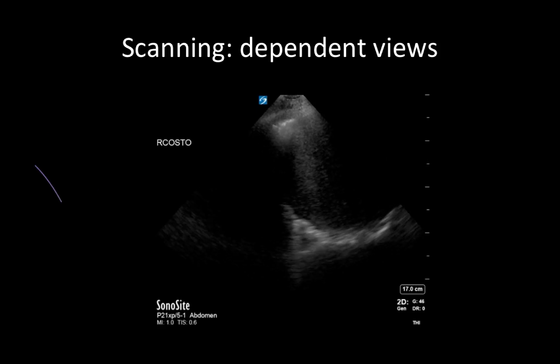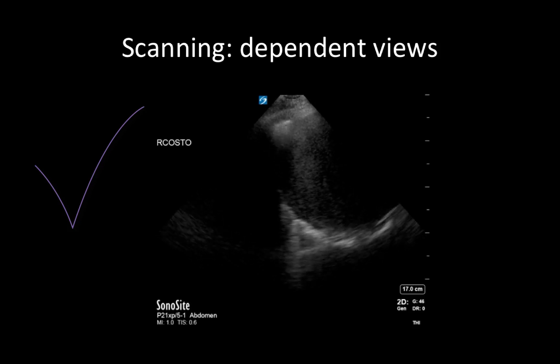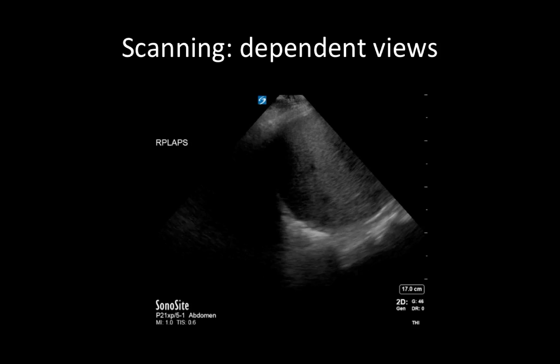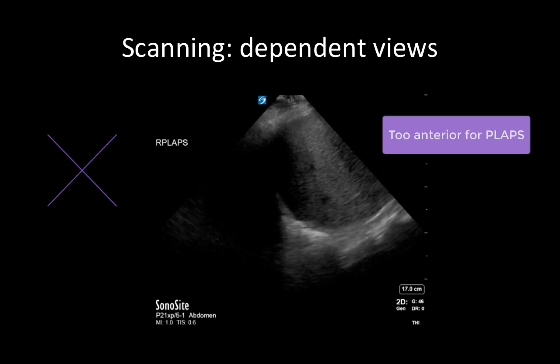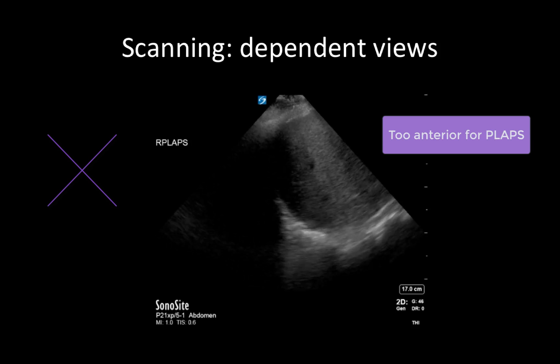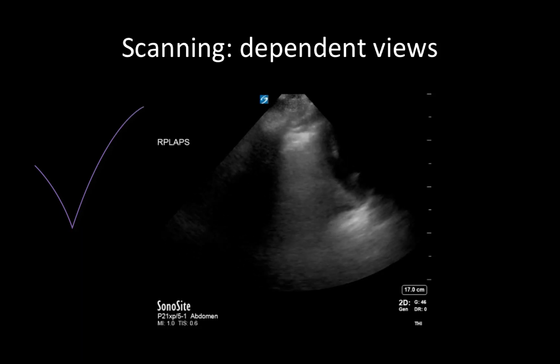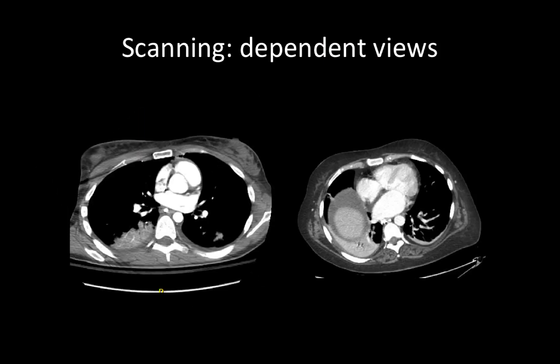This view shows an appropriate costophrenic window. We see liver and diaphragm screen right, with lung curtain sliding across screen left. Note that we don't see the entire diaphragm, as there is no large consolidation or pleural effusion to act as an acoustic window, and ultrasound beams do not travel well through aerated lung. Another common mistake is not getting posterior enough to truly visualize dependent pathology. By sliding more posteriorly and angling the probe into the lung, we can see that in fact there is a dependent consolidation present with a small associated pleural effusion. Axial CT cuts demonstrate how a small posterior consolidation could be missed if lung ultrasound views are taken too anteriorly.